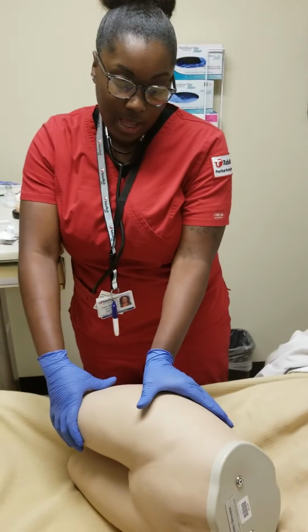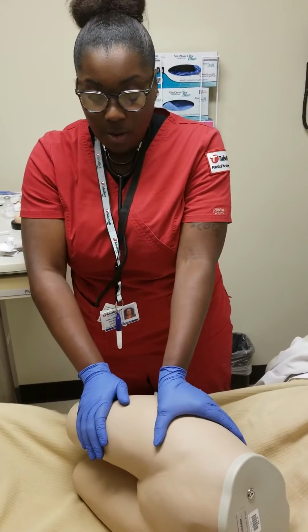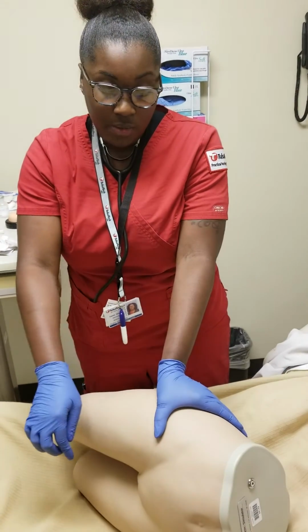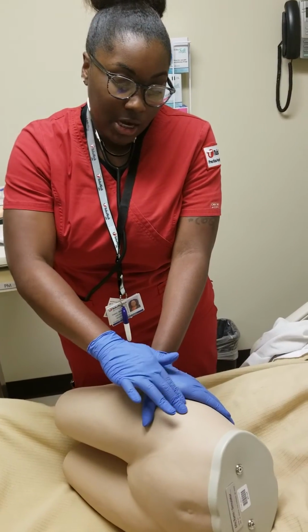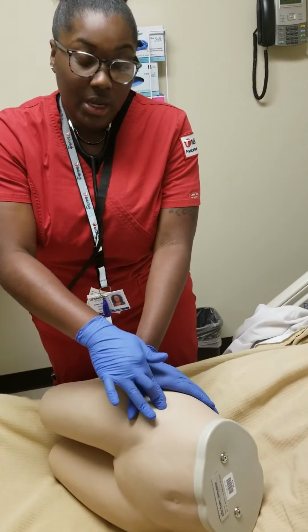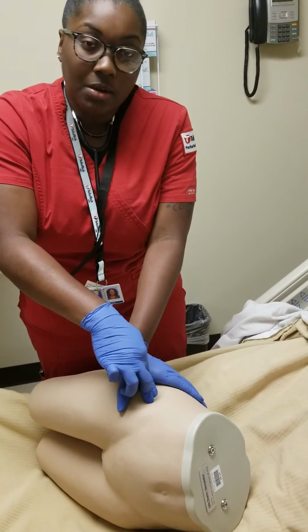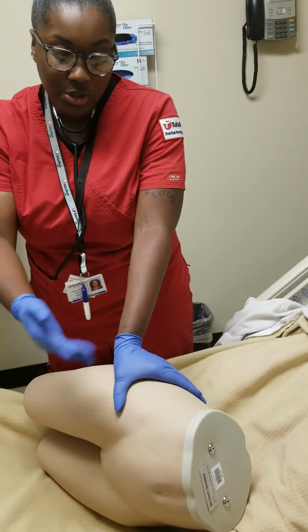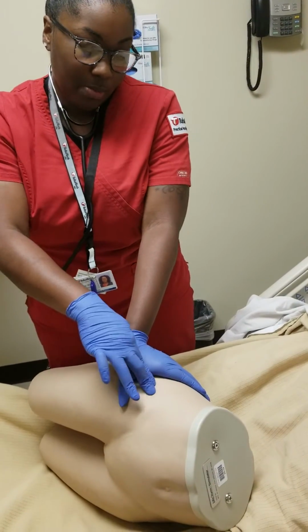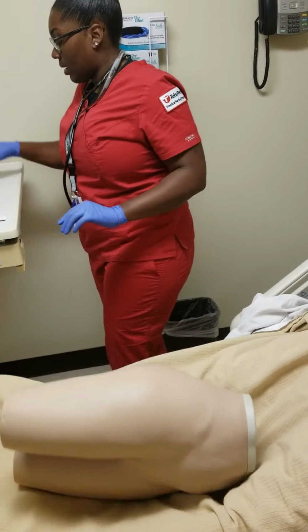I'm going to place my hand on their gluteus with my finger pointing toward their groin area. The area in this, my big V, is the area where I will be administering the injection. And as you press down, you'll be able to get down here in the opening. So I'm not going to inject into the mannequin, but I wanted to show where that area will be. So just as if this was the area, I would clean my site.